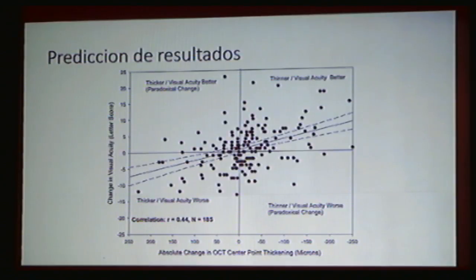We go back to our patient saying, look at your OCT, it's great. It has decreased 150 microns. And the patient looks at you saying, you must be nuts because my vision is actually worse. So what would be the explanation for that?